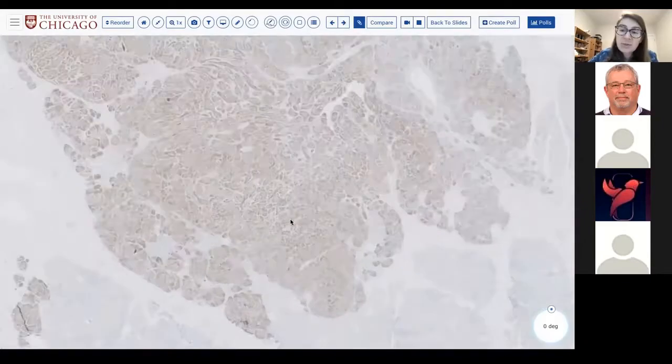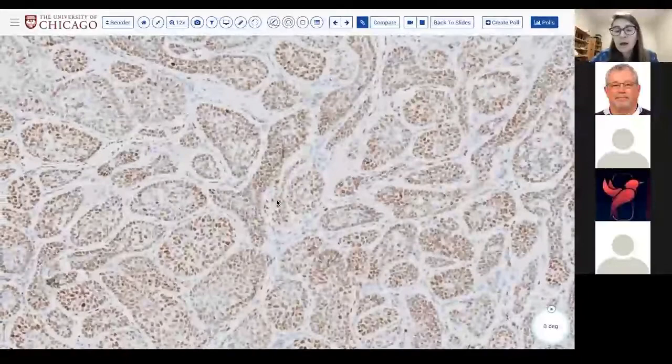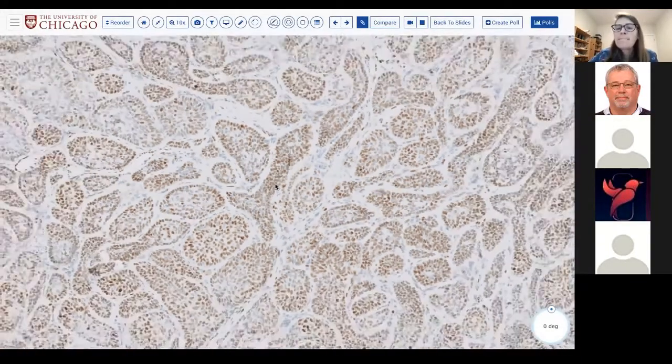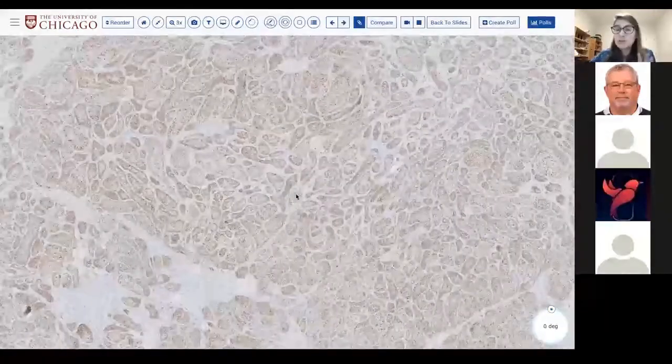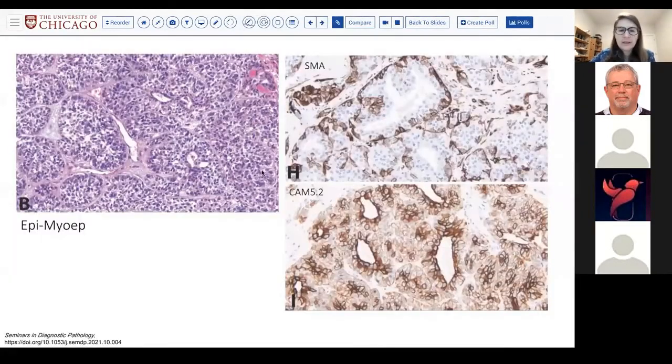And one additional marker that has sometimes been used in basal cell neoplasms is LEF1. So this is LEF1, as you can see, nuclear. But I don't really use it as specifically because it also stains nuclei of other neoplasms like pleomorphic adenoma or other biphasic things that are in your differential. So unfortunately, I do not think LEF1 is quite as specific. I do think beta-catenin is good for basal cell adenomas, but not for basal cell adenocarcinomas. And LEF1, I don't like. Does that make sense? Okay.